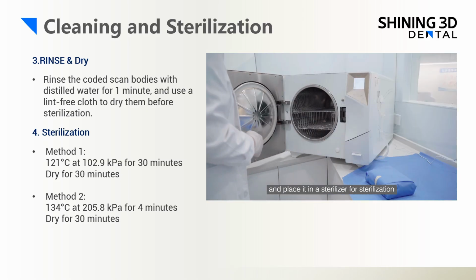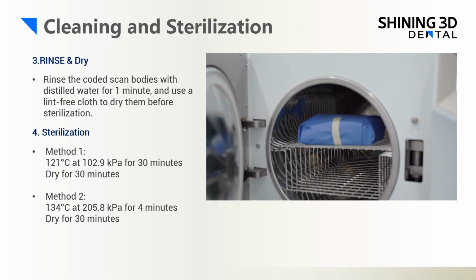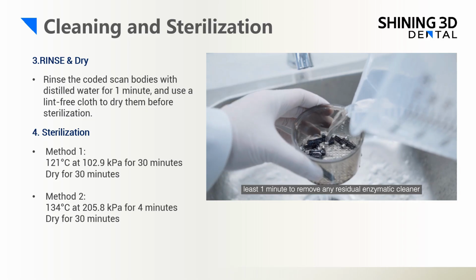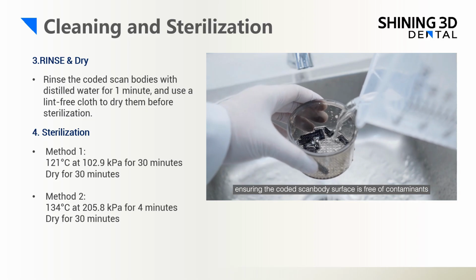121 Celsius degrees at 102.9 kilopascals for 30 minutes and dry for 30 minutes. The second option here is using the temperature of 134 Celsius degrees at 205.8 kilopascals for 4 minutes, and you can dry it for 30 minutes.